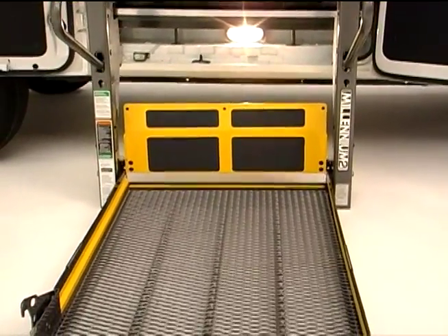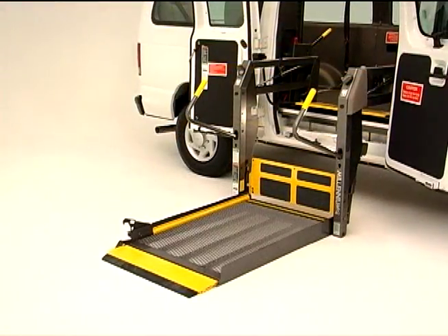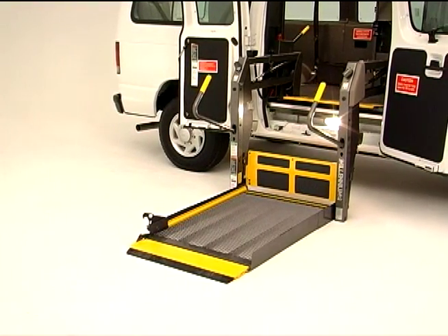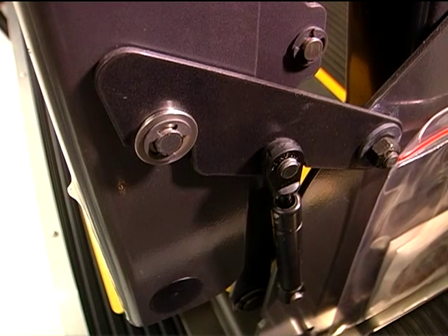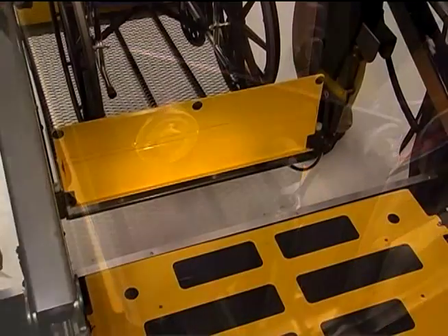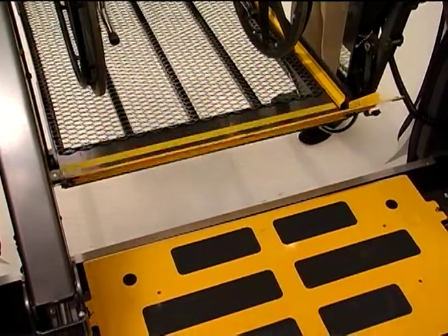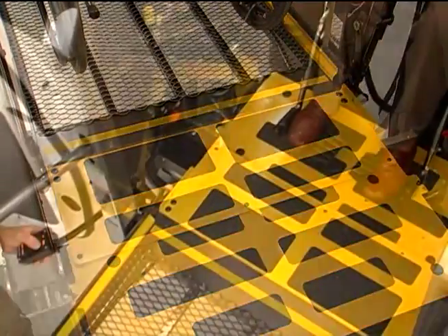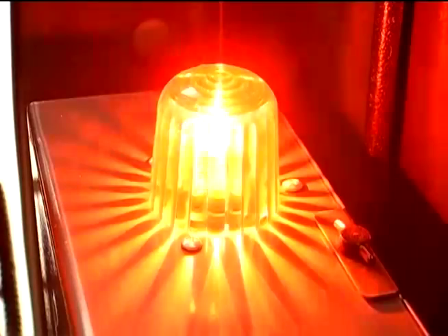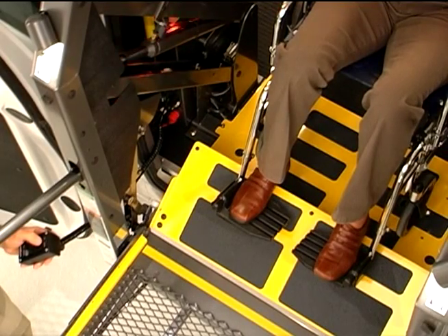Before attempting to operate your lift, it's important to know that Braun has several built-in safety features working for you. The Millennium Lift is designed to help prevent conditions that could result in accidents or injury to passengers or operators. Lift-tight latches prevent the platform from drifting at the stowed position due to bleed-off of pressure common to hydraulic systems. The automatic inner barrier automatically deploys to its horizontal position to serve as a bridge between the platform and the vehicle floor, and once fully deployed, rests on a threshold warning plate, which senses weight and will activate both a visible and audible alert if the inner barrier is occupied when an operator attempts to activate the lift.